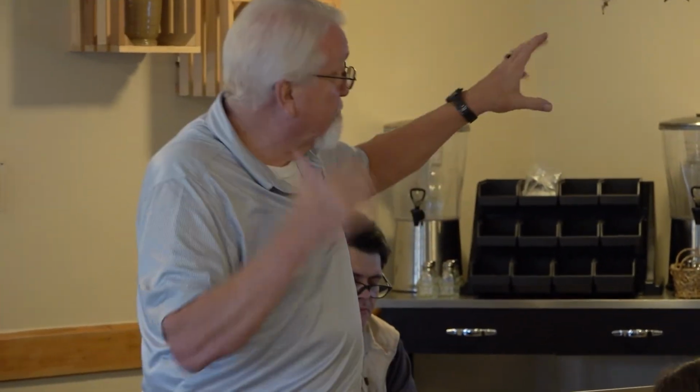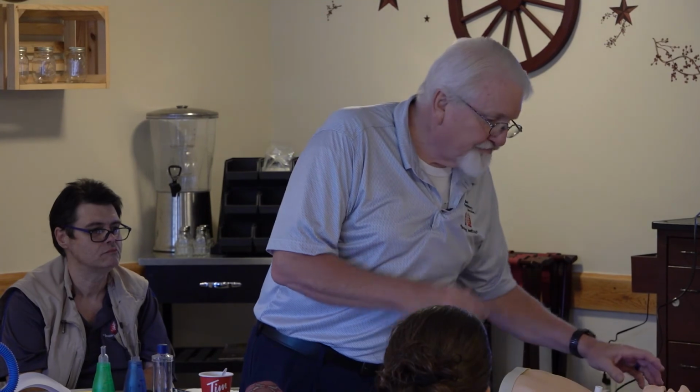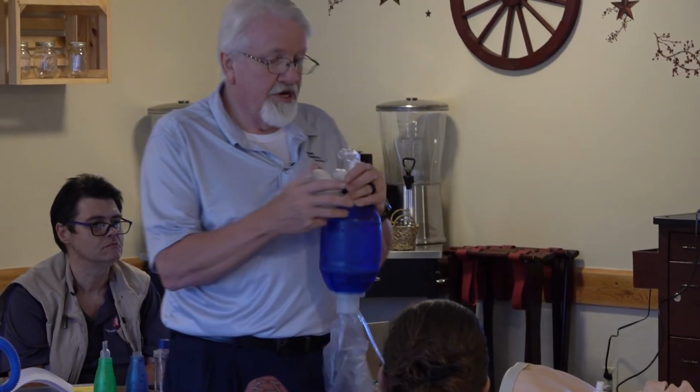Let's see. I was going to say there's something else. Yeah, the laryngectomy patient. So you really need to know, if it's a laryngectomy patient, normally you're going to have a sign on their wall at the head of the bed. It's going to say neck breather. So you want to be aware, if you have to work with a trach patient or a laryngectomy patient, you need to know this ahead of time. You know, if he needs it, am I going to have to make sure I run in there with a syringe so I can inflate his cuff?